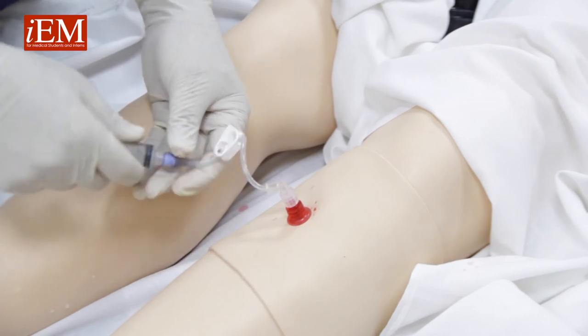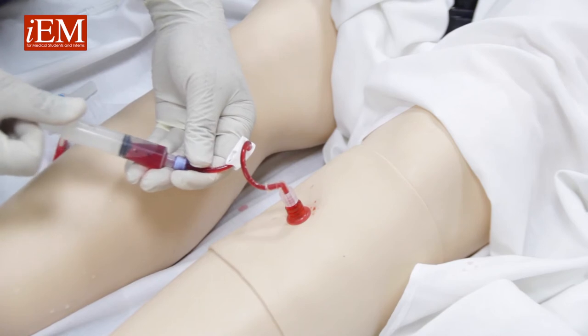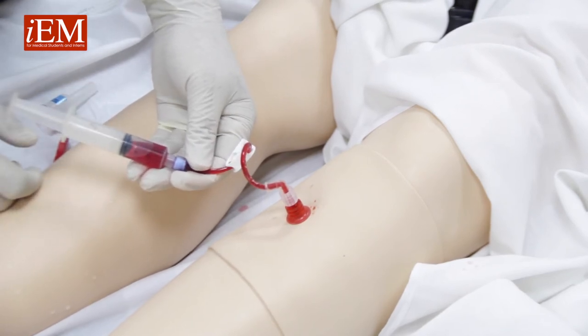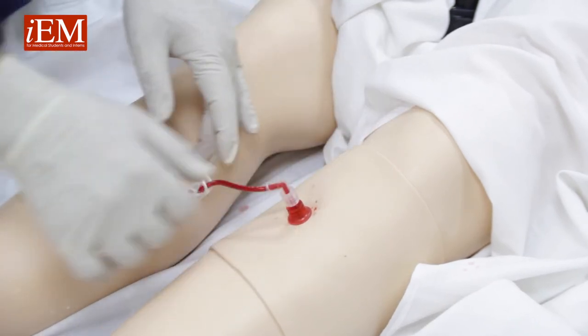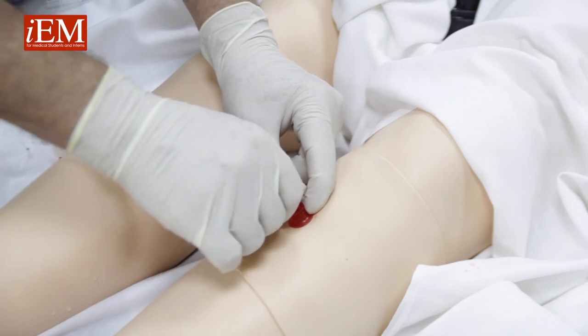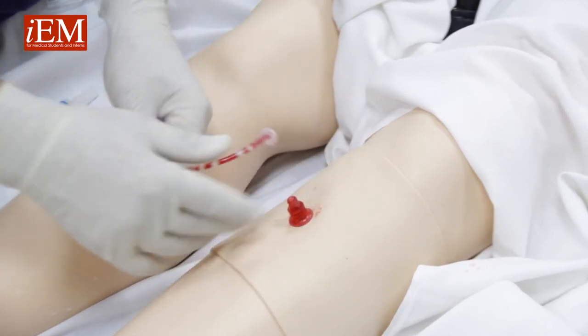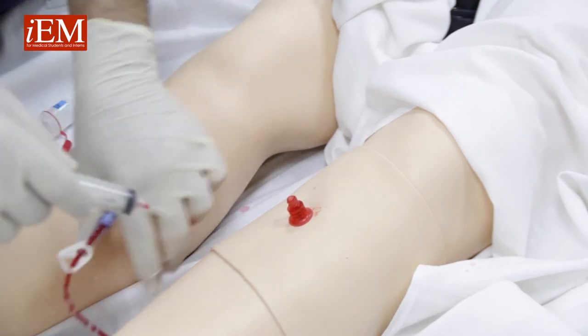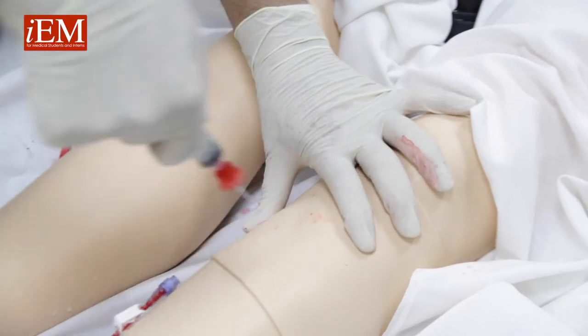Now we can aspirate, and now we have an IO. Now we're going to show you how to remove an IO. Take out your connector and take your needle insert, and with a clockwise turn and pull.